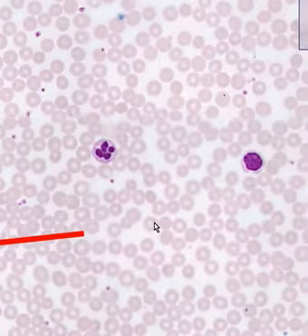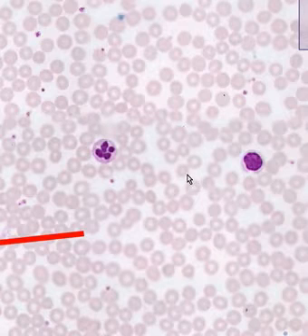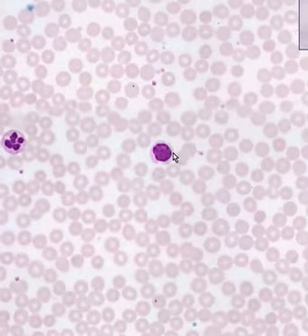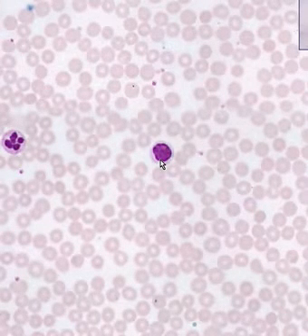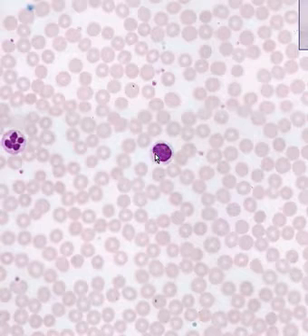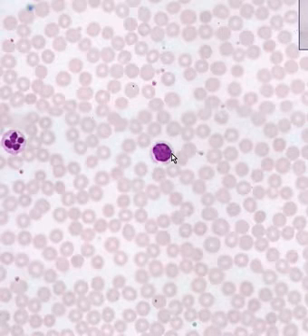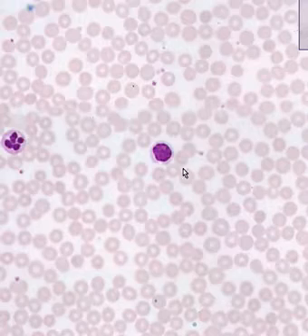The red cells average about 7 microns in diameter, but the more reliable measuring stick on a blood film is a small round lymphocyte containing a round nucleus and a minimal amount of cytoplasm. And the diameter of these is about 10 microns fairly reliably, which you could see is a little bit more than the 7 microns of the average red cell.